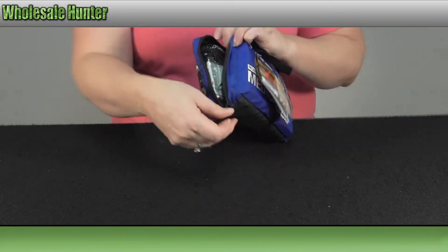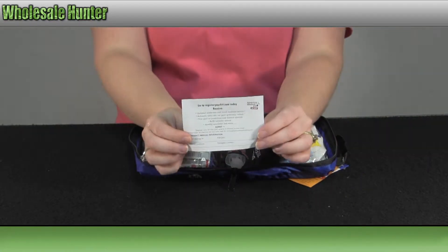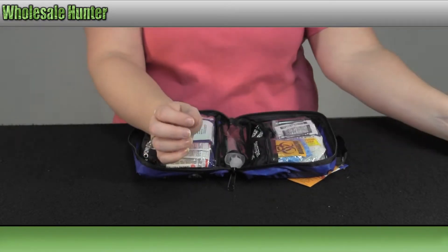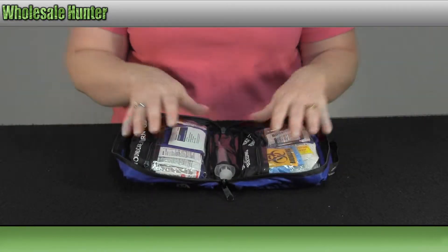We're going to open it and go over everything that it comes with. First off you have your registration and your thank you card from the manufacturer. This is how it's packaged on the inside. Each compartment is labeled.